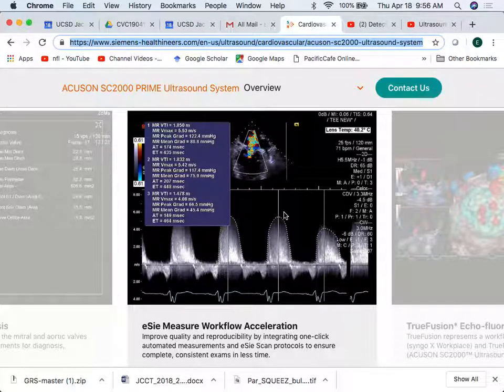Velocity up means towards the transducer. Right? Velocity below this line means away from the transducer. So what's happening? So I'm looking at the mitral valve. I'm measuring my peak velocity right down this zone here. And my velocity is increasing and hits a peak value at this time. What do you think is occurring at that time?